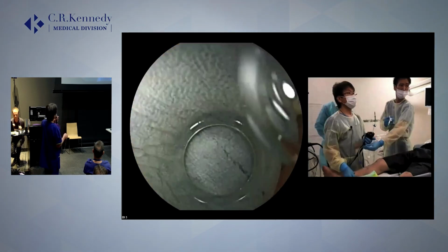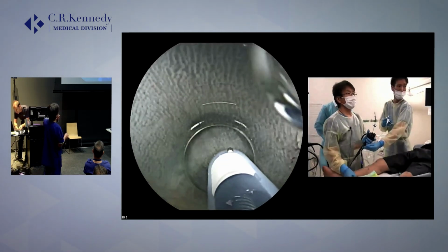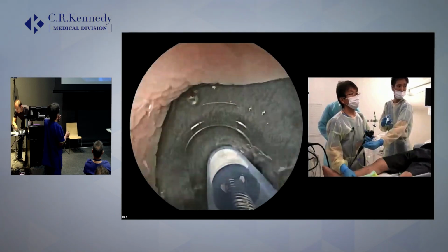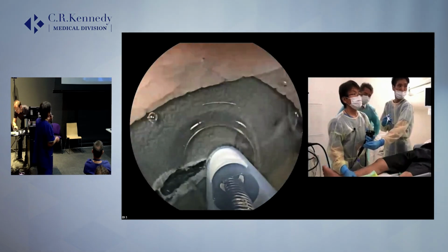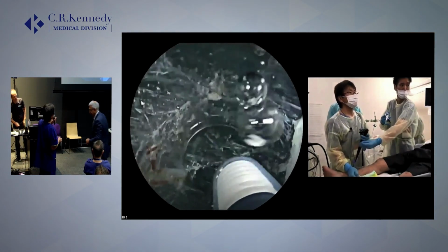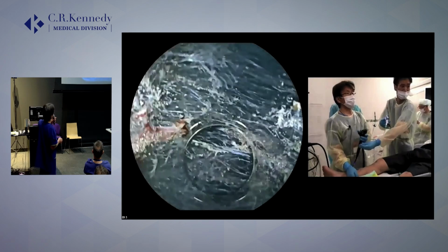And this is an end cut of the mucosa. And cutting the distal side of the mucosa, and then I create a pocket, submucosal pocket. So in the saline, endoscopic view is very clear, and even in the saline, I can use the electricity.